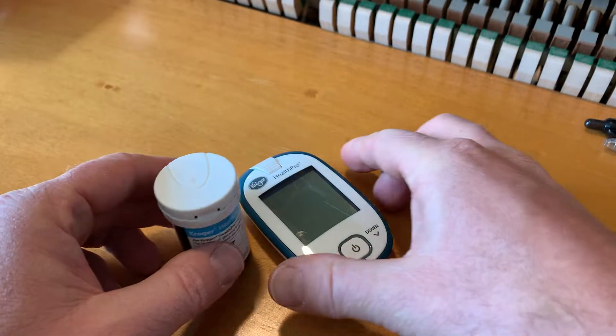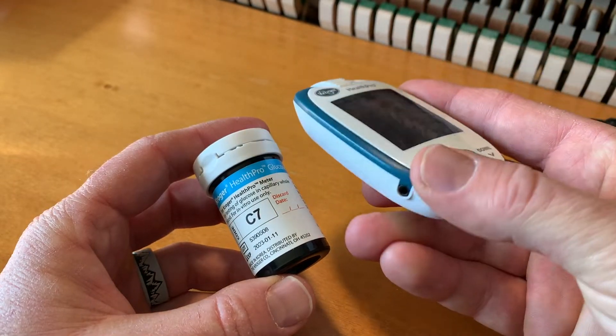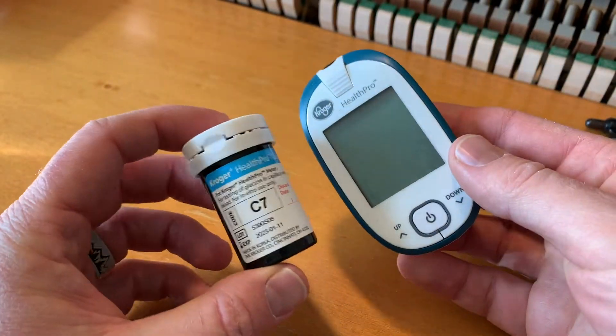Hey friends, on today's video I'm going to show you how to properly load one of these testing strips in this Kroger Health Pro glucose monitor. It's actually pretty simple. Let's do it.